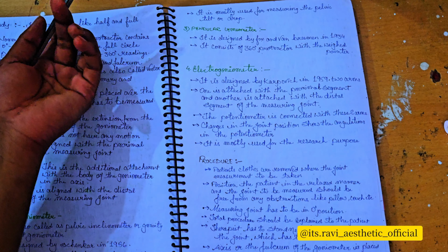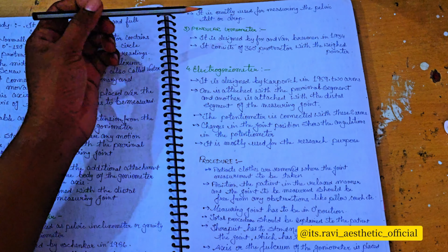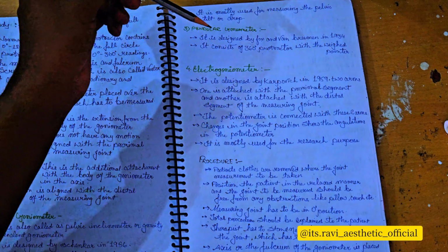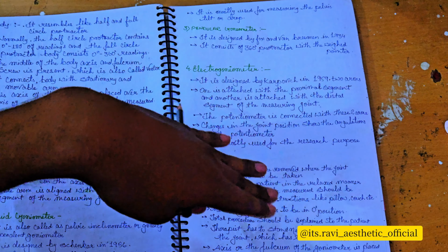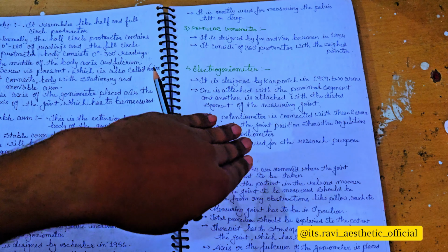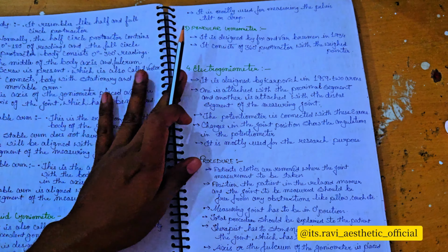So what is the pendular goniometer? The pendular goniometer was designed by Fox and Van Breemen in 1934. It consists of a 360-degree protractor with a weighted pointer. So basically the pendular goniometer is a weight dependent goniometer. If you have a weight on a hand, once neutralized, it can tell us digitally what the range is. It is not accepted worldwide. It is used for some small joints.